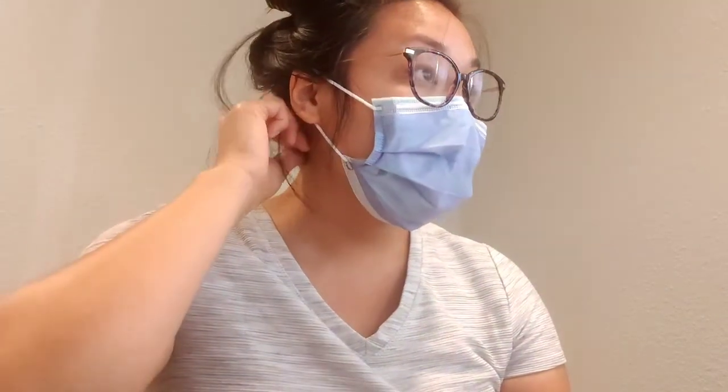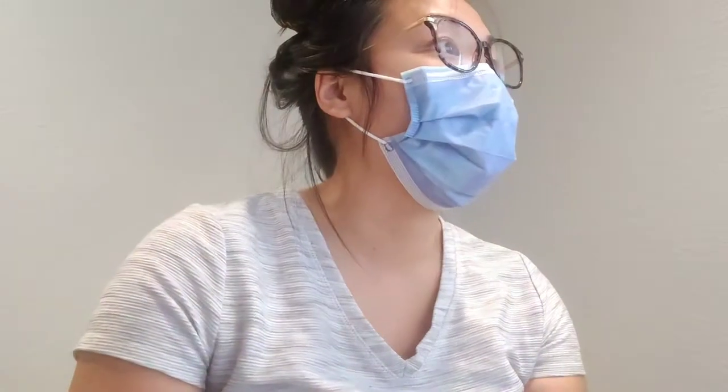Interesting. Okay, next question. The scout or topogram image for a CT head must include through the vertex of the skull, C1. So you want your first cervical spine to be included in your head scan, because I think it's right where the skull is and your medulla oblongata and all that stuff, the brainstem comes down and connects to C1, so it should be included. Not a radiologist, I don't get paid that money, but hey, C1 included in your head.